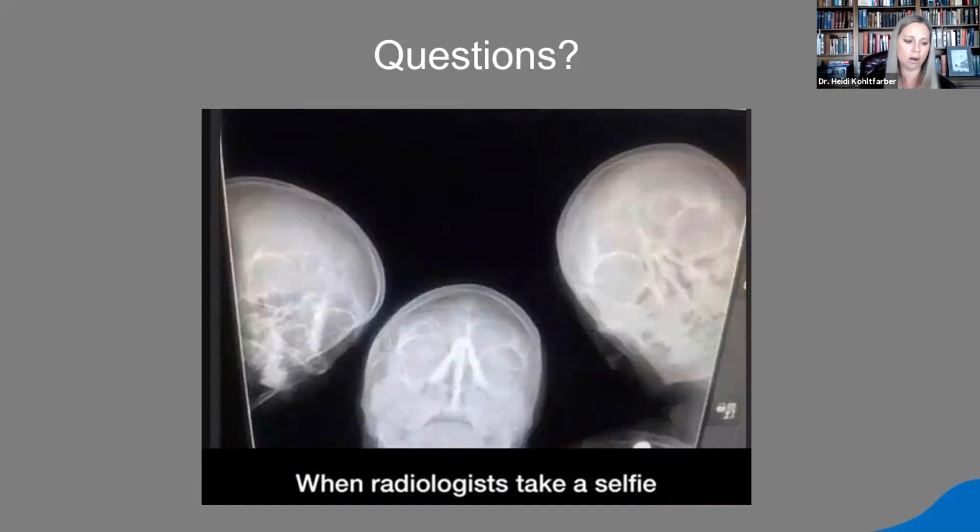And I know that there are various schools of thought as far as that goes. Some people say every CBCT should be sent on for a radiology report. I'm not necessarily going to say that. I didn't go to a school that had that particular thought process. But I do think it's smart to document that you have reviewed the CBCT. And so from that standpoint, I would say every CBCT should have some sort of a report.